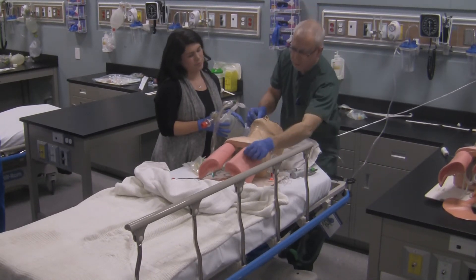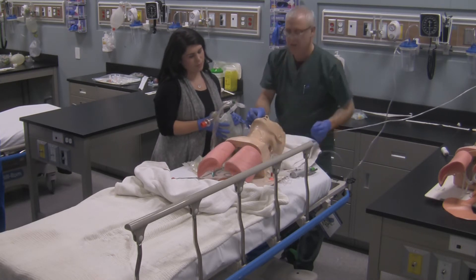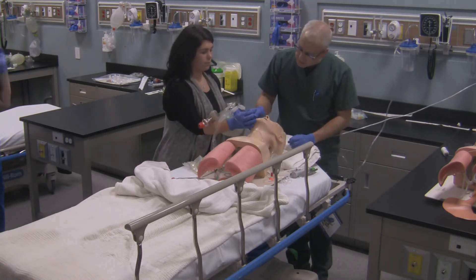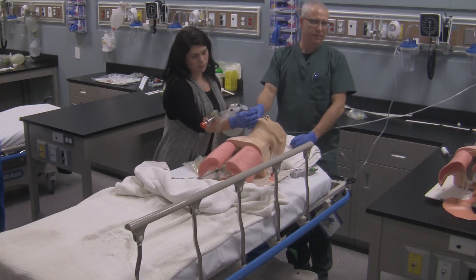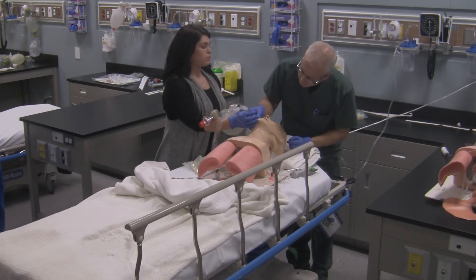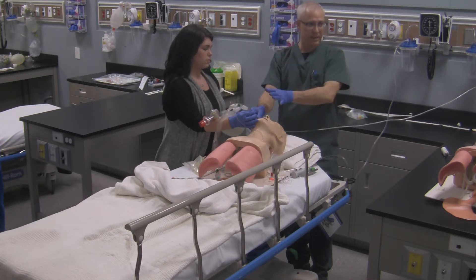I take my stethoscope, listening over his lungs — good air entry, equal bilaterally. You can see it's expanding nicely. Listen over the stomach — nothing coming from the stomach. The tube is at 22 at the patient's lips, 21 at the patient's teeth. That's my landmarking. When I put the tube in, I also looked to see where the tube was sitting after I pulled the laryngoscope out. It should stay at that spot.